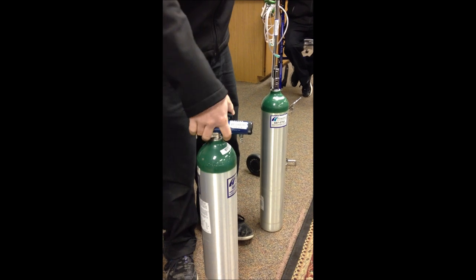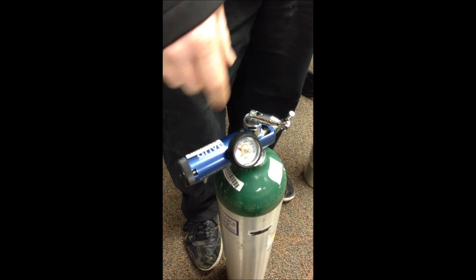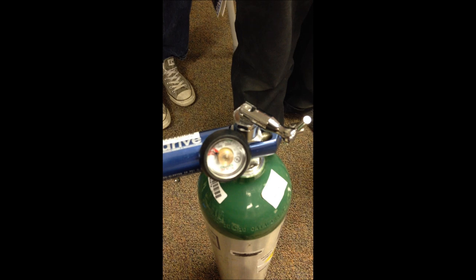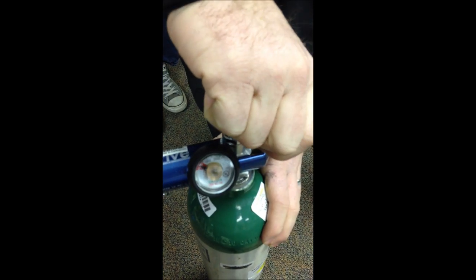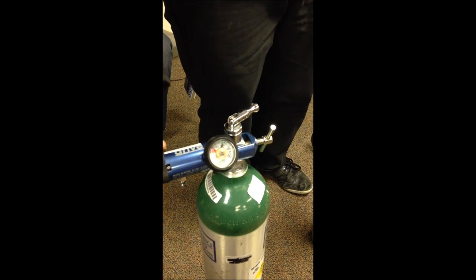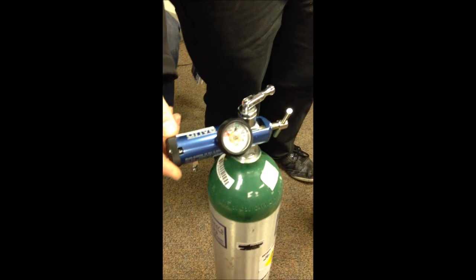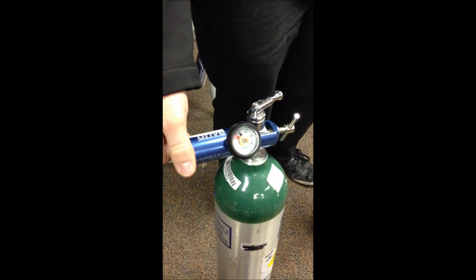Once it's on there, if your regulator's set to zero — these numbers, usually one through eight, one through ten, or one through fifteen, are all in liters per minute, like your oxygen concentrator — it's still going to show the dial at zero. That doesn't mean your tank is empty; you just haven't opened the tank to see how full it is. To open it, turn the lever that's already connected onto your tank, or use your key — all you need is a quarter of a turn. You'll hear a little pop and see the dial go up to about two thousand PSI, or however full the tank is. From there, you can adjust your liter flow to your prescribed liters per minute. If you're at two liters per minute, just turn it to two.